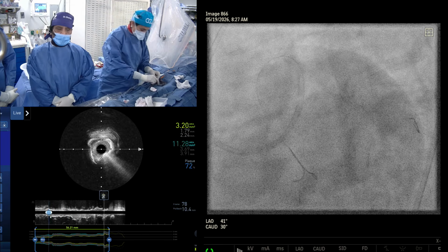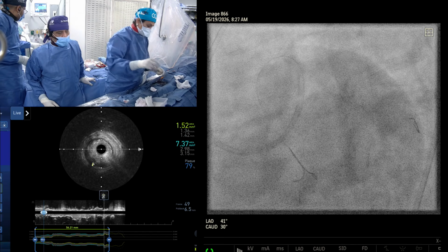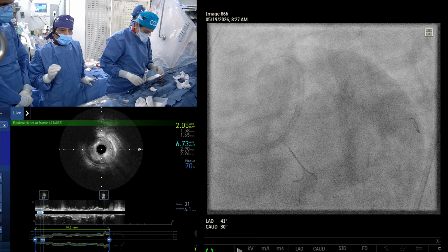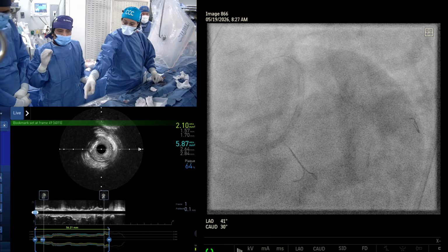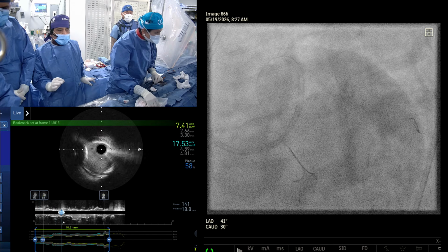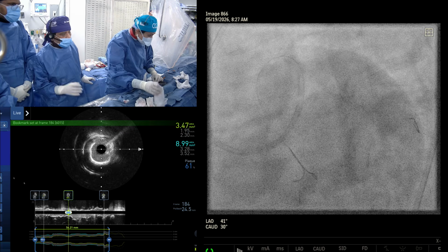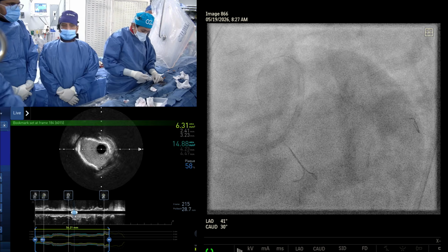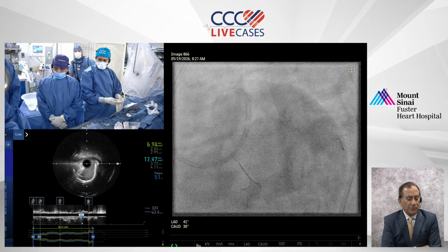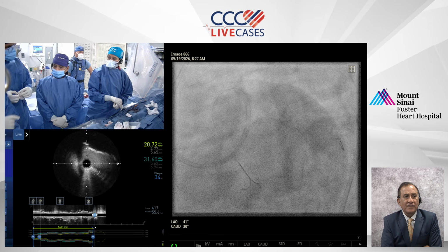So coming back to Samir, your question. You probably heard that now I have made the point. Nowadays, in this day and age, with the advent of safety of the IVL, your second burr is IVL. Very simple. Either you use a 1.25 burr, whatever you use, if you want a second burr, it is your IVL. Excellent, which was also a question asked by a few people about proceeding with the 2 burr. Instead, the second burr is IVL.